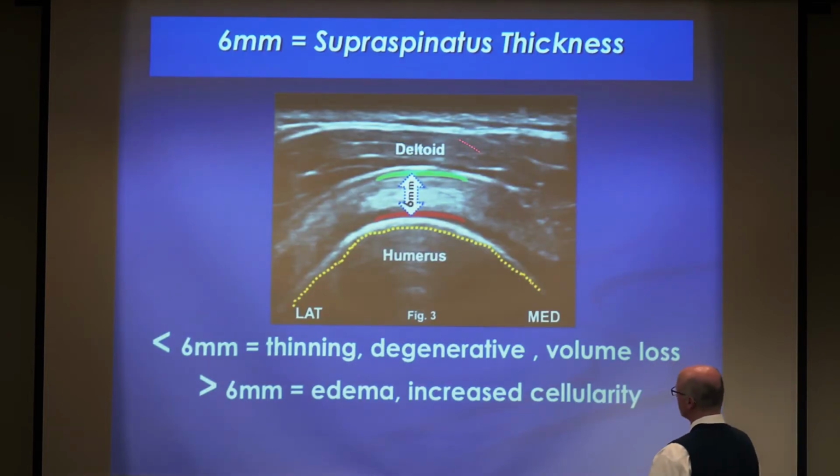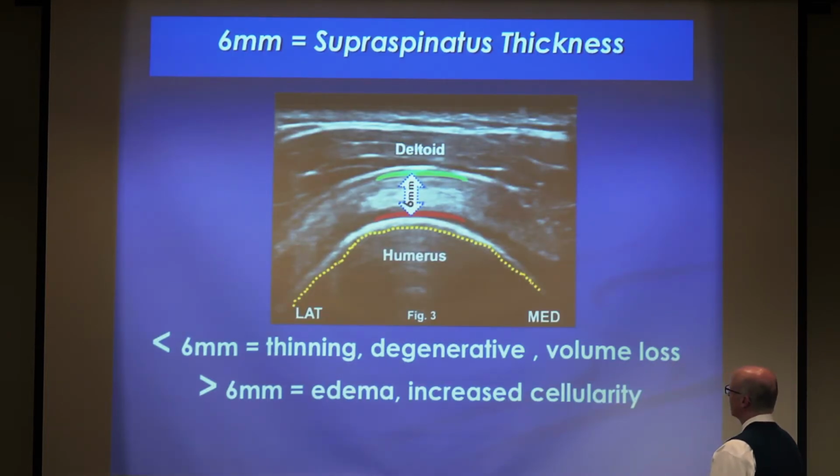Okay, so with regard to adding a measurement to the grayscale findings on the supraspinatus tendon, at the apex of the humeral rim, the value as a good average is 6 millimeters. Now when you place your cursors to do this measurement, be sure to not include the bursal interface or the cartilage interface as part of your measurement. So that's why the interface identification, the interpretation algorithm continues to be very important.